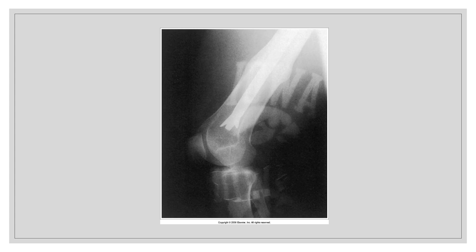What type of artifact? External. There is printing on the sweatpants. There also is an IM rod, which is an internal artifact. And then there is something further down, maybe on the tibia, fibula, maybe part of the sweatpants, or it could be the brace of some kind.